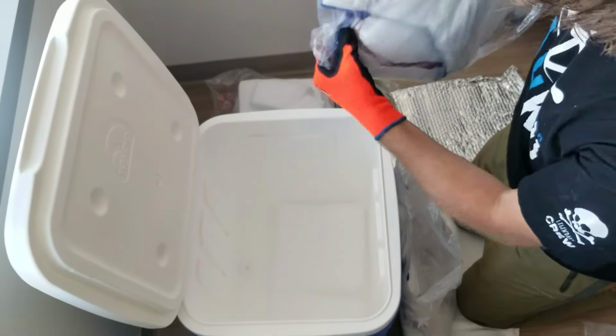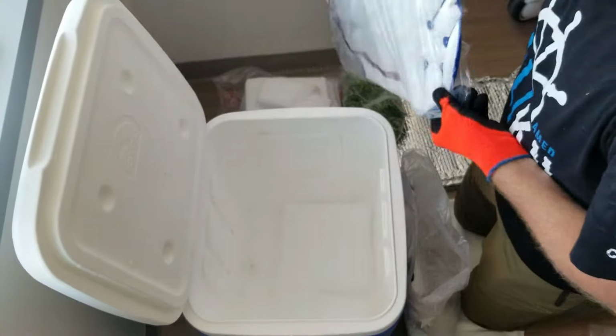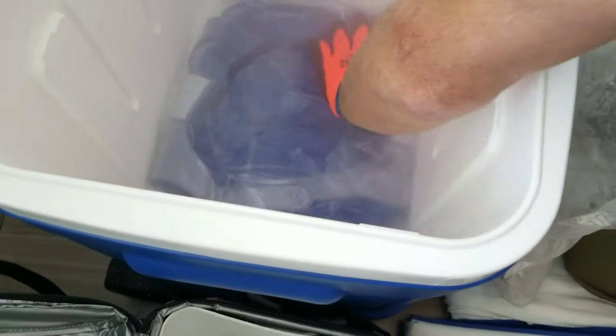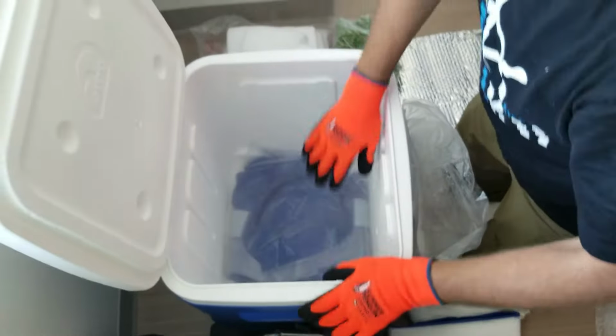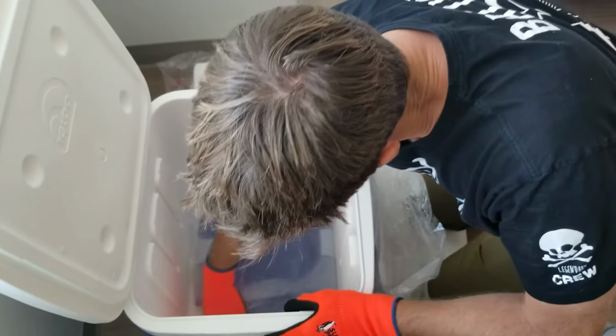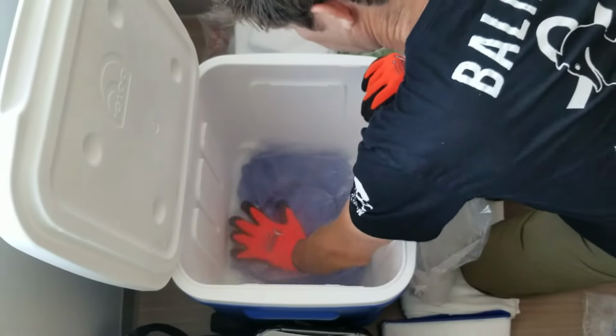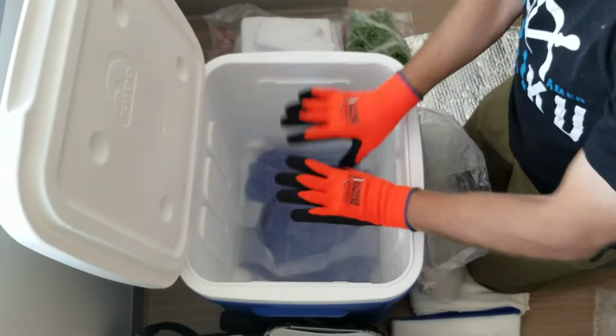And so now I'm going to take the one that just came off her head, and I'm going to put it in the bottom. Keep it in the bag. What's in the bottom? That's dry ice in the bottom. So it's facing the white side down to the dry ice. And you want to make sure that you get it down into the dry ice. So just make sure it's all through there. First layer, blue side, so white side down.